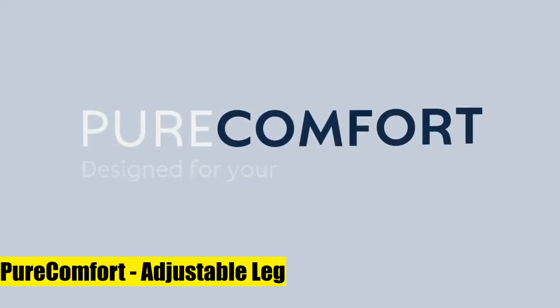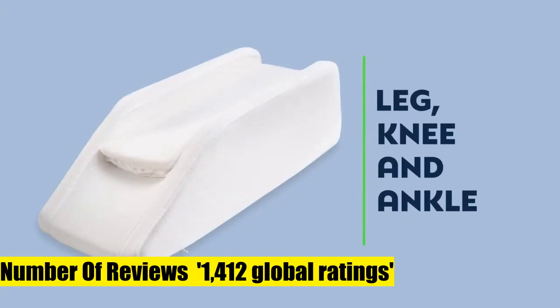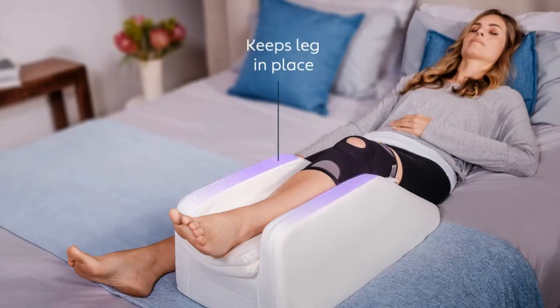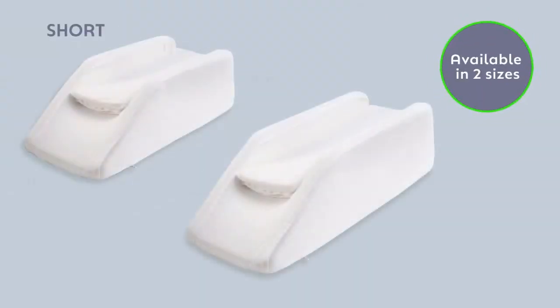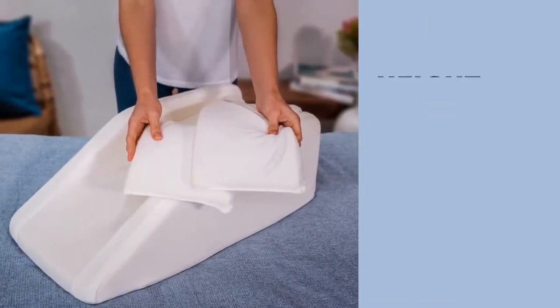Pure Comfort adjustable leg elevation pillow — the short version allows your ankle to be free from contact. Say hello to the first leg elevation pillow designed specifically to elevate your leg, knee joint, or ankle to facilitate healing, circulation, and recovery. Whether sleeping or awake, this leg pillow keeps your leg still and elevated to treat knee pain, swelling, and pain. The custom channel design accommodates cold or hot packs.